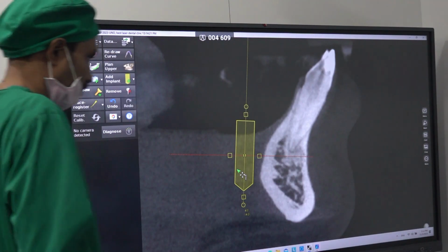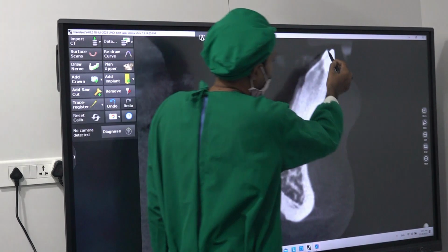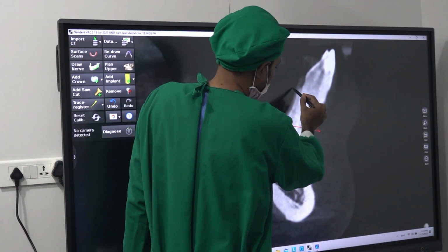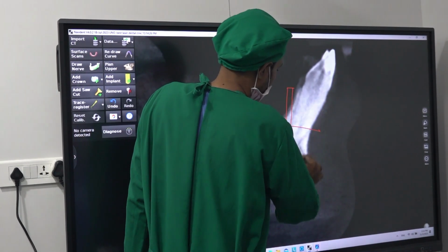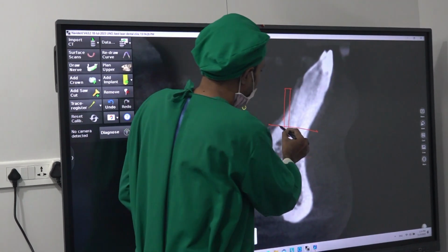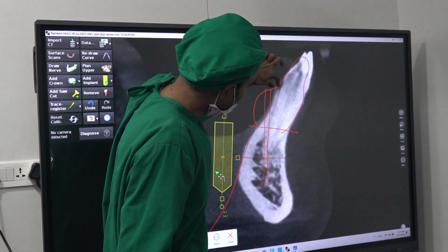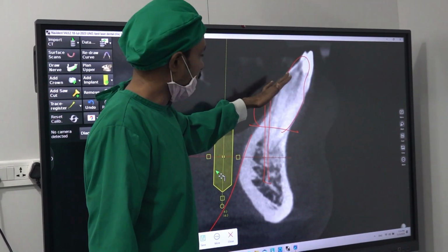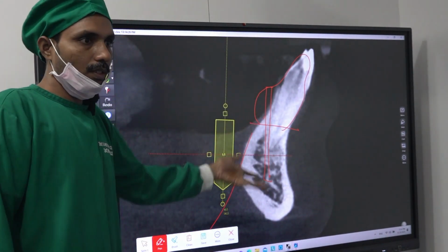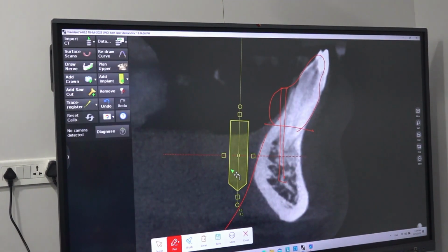See the problem, the prosthetic challenge we get in this patient is, the tooth is here. Once we do alveoloplasty, we will be placing the implant here. But previously the tooth was here, so we have to give the tooth here. So we are interfering with the tongue space here. The patient will be complaining about the tongue. So for this kind of patient you have to tell them before: the tongue may be difficult to accommodate in the initial stages. Now later the planning is over.